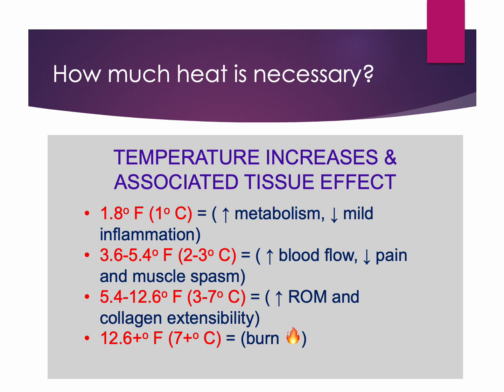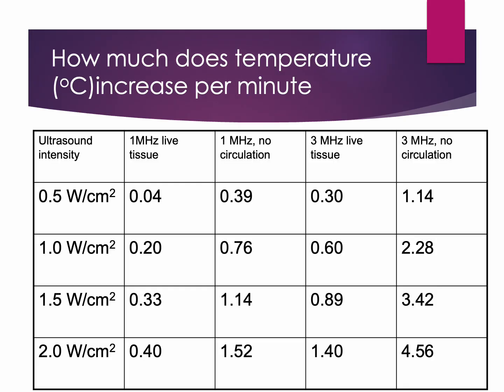Of particular importance is how much heat will lead to a burn. You need to ensure that your ultrasound settings do not increase temperature by 7 degrees Celsius or more, or you could burn the patient. This table can be intimidating at first, but shows how quickly temperature increases based on intensity, frequency, and circulation.